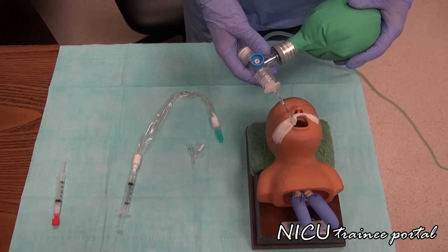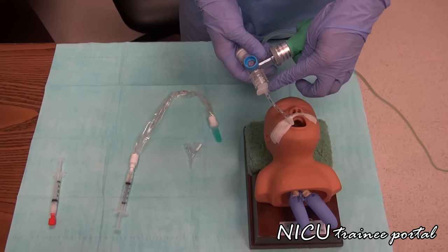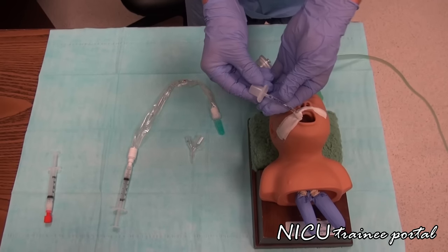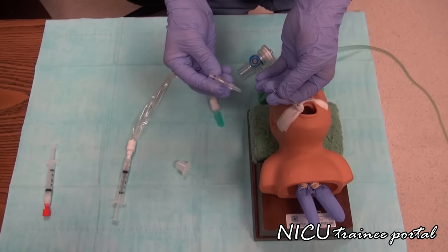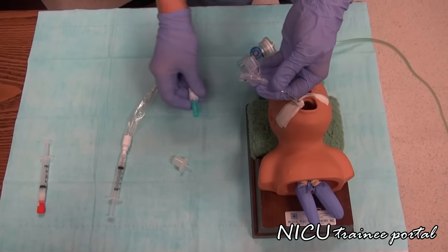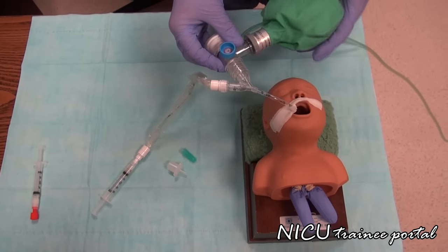Now we have the baby intubated with a 3.0 ET tube being manually ventilated with the bag. We have the stock adapter that comes with the ET tube currently in place. So we will disconnect the bag, remove that adapter, take the 3.0 adapter that comes in the kit, place that in the 3.0 ET tube, then take our catheter, remove the blue cap, put that end in the smaller port, and reconnect our bag to the larger port.